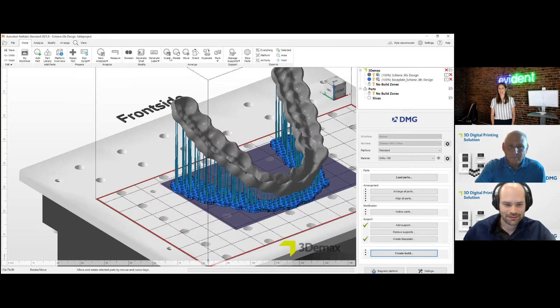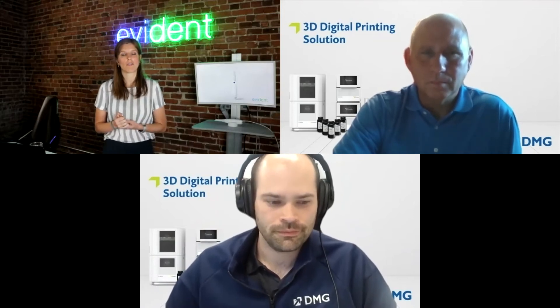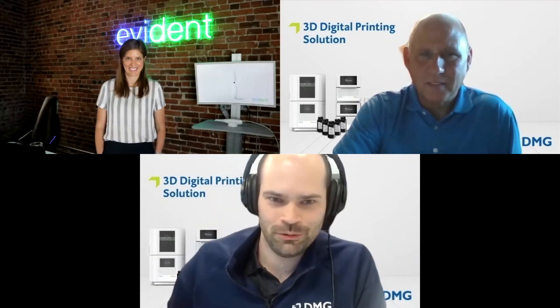Here we have all those individual slices — each one is essentially a picture that the printer uses to build the model. Then I send to printer, or you can download to a flash drive and plug it in. That's all for nesting — easy. Evident's Design Center can also do the nesting themselves; if you want a completely hands-off process, the team can design the night guard and make it print-ready so the file just needs to be loaded into the printer and you press print.